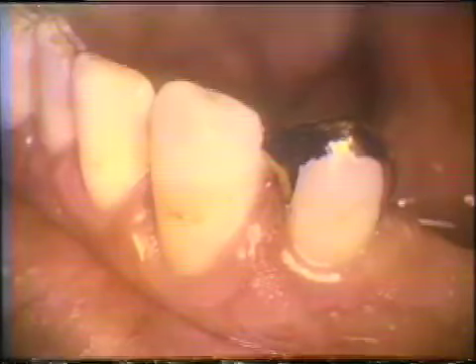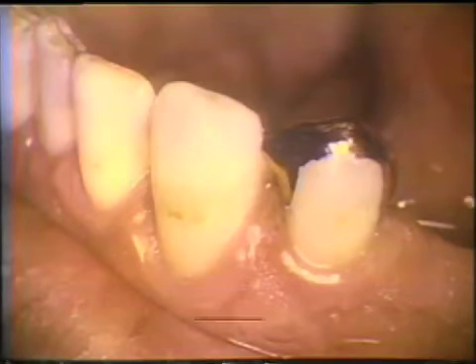It is vital that the arch is an integral unit and that there are integral contacts interproximally with the abutment teeth and its adjacent tooth. If they are not there, the appliance will drift mesially with the teeth, causing impingements in the lingual bar area.